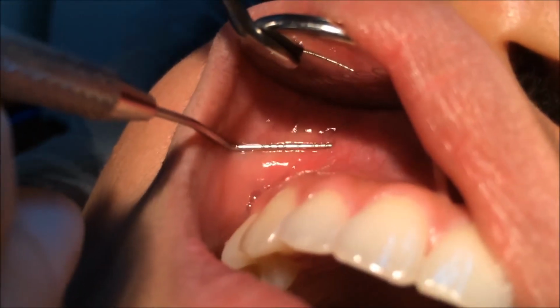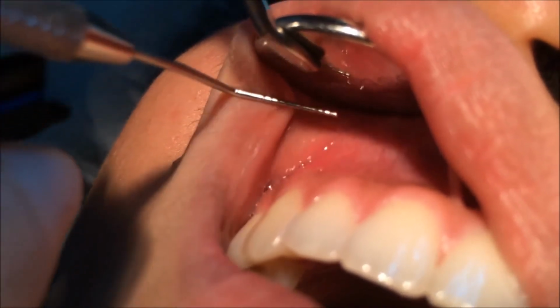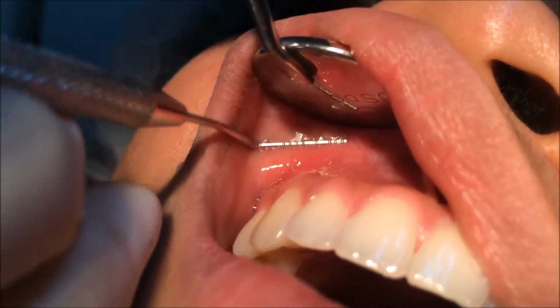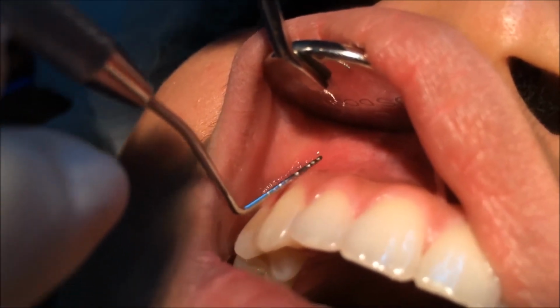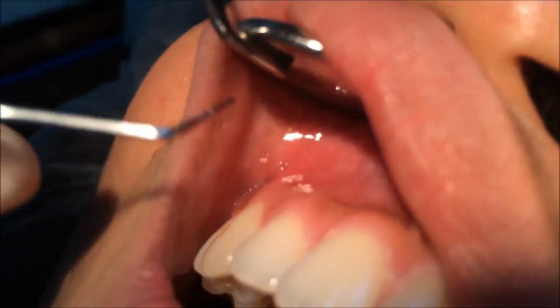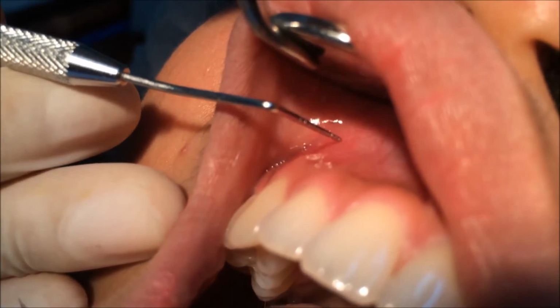The target area is the apical region of the tooth to be anesthetized. The landmarks are the mucobuccal fold, the crown, and the root contour of the tooth, which serve as guidelines showing how the needle would be inserted in the proper position.